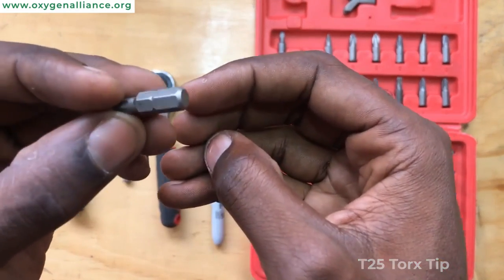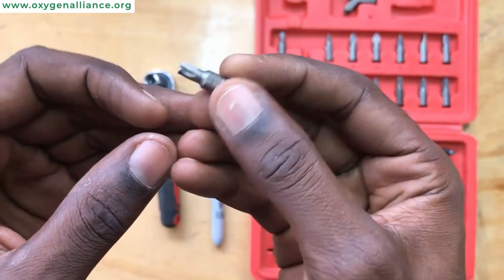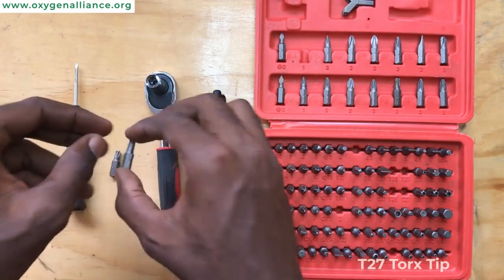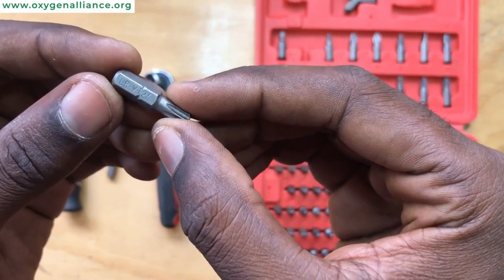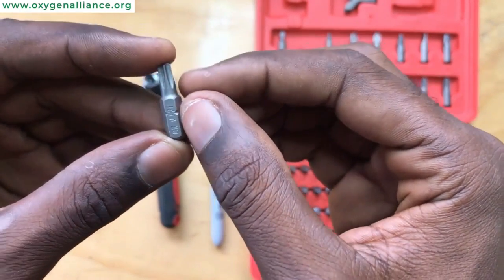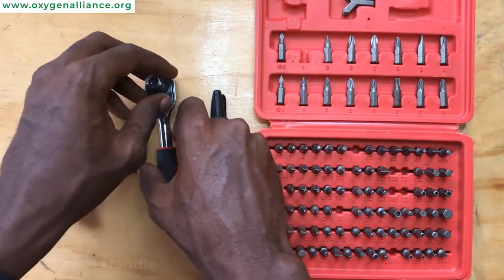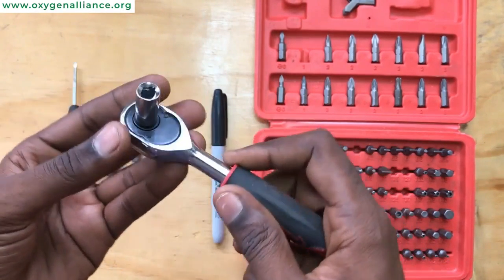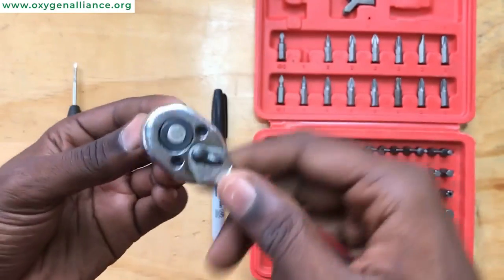Secondly we have the T25 Torx tip — we use this one to unscrew some of the screws on the compressor. Then we also have the T27 Torx tip, which we also use to unscrew some of the screws. And then we have the ratchet and a 6mm socket, which is the one we use to remove the screws from the compressor.